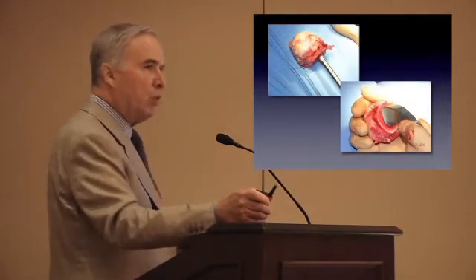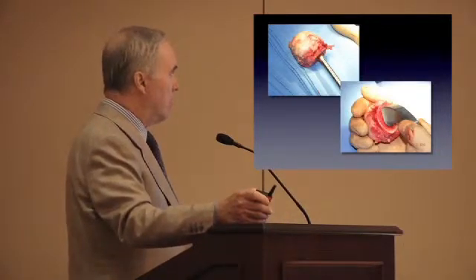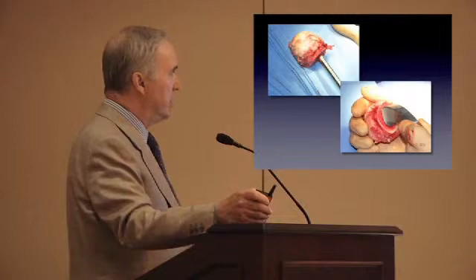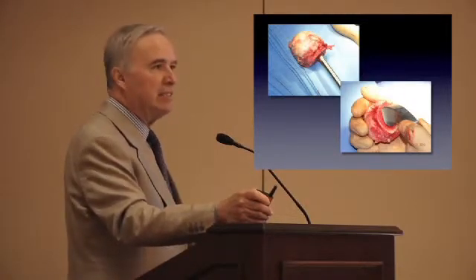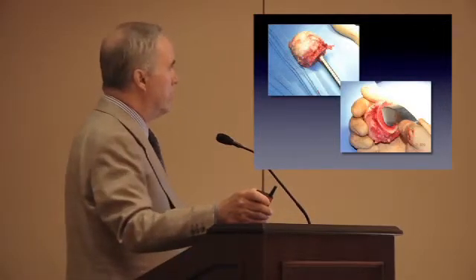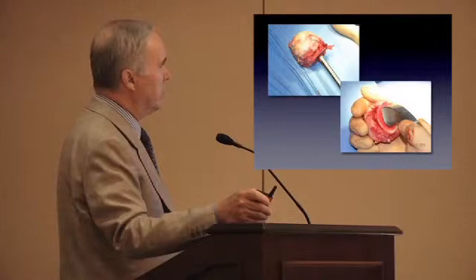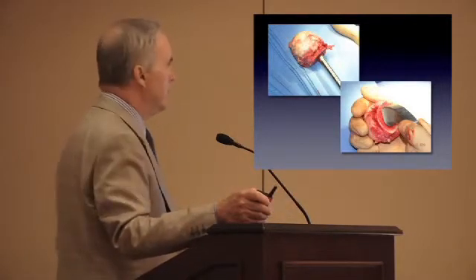And then I turn the head over, and I take my trial stem and place it across the cross section of the head, and I should say the neck, and get a guesstimate of what size implant I may be putting in here. So it gives me a cross section, with one saw breadth removed, of the neck I'm working with.